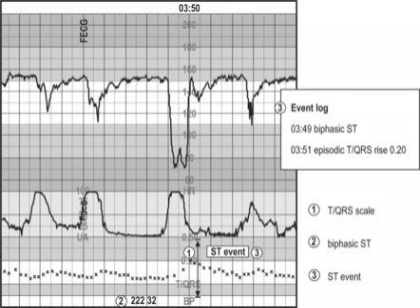This reduction in interventions is nothing to sneeze at, but it bears keeping in mind what was needed to achieve it. Rupture of membranes was needed to be able to place a scalp clip, which we know is associated with higher chorio rates, and then also scalp pH with its attendant risks was also utilized to further classify these fetuses. The cost, training, and equipment needed for these additional tests is also something to keep in mind.